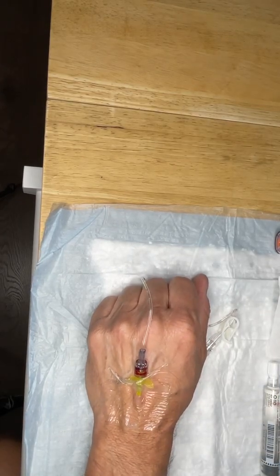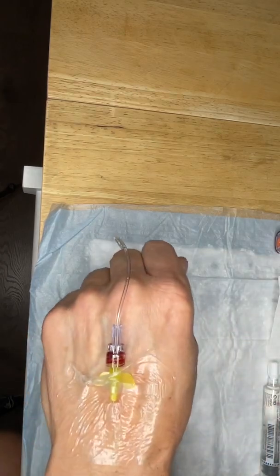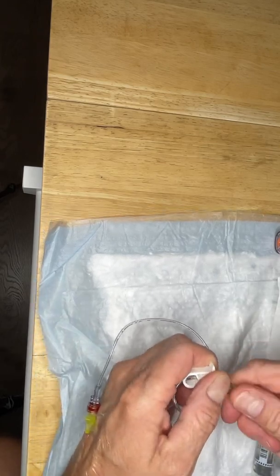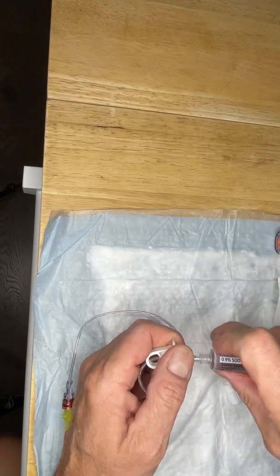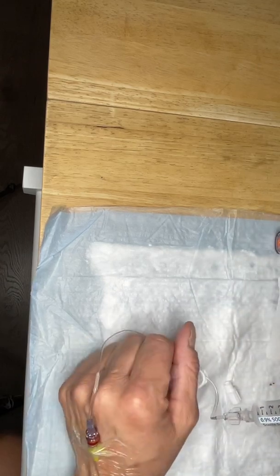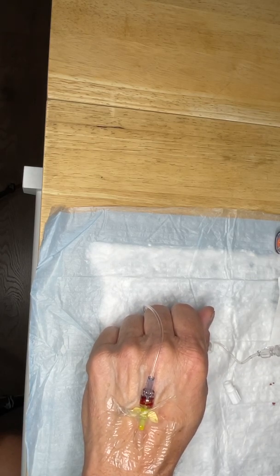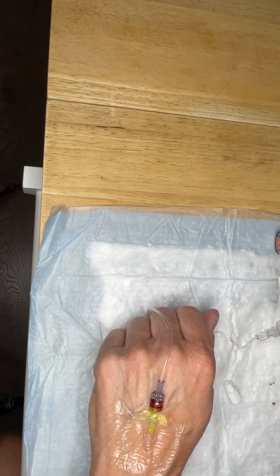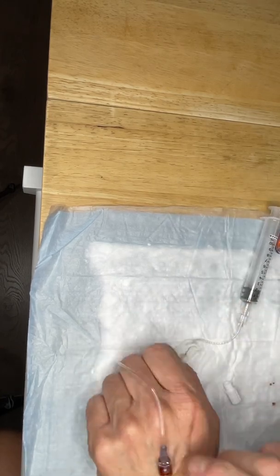Alright, so I just squeezed every little bit out of the bag. Now I'm going to disconnect it. Flush it with the saline. Here we go. Shut that so it doesn't get messy.